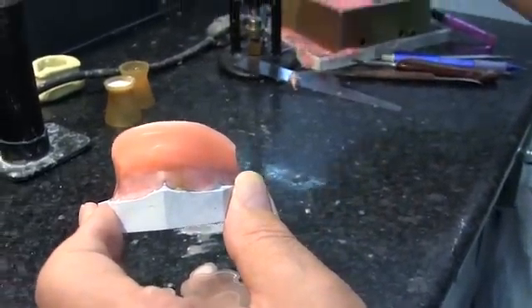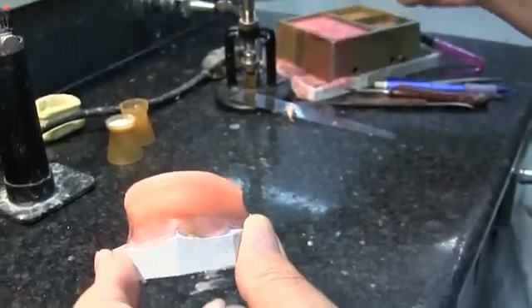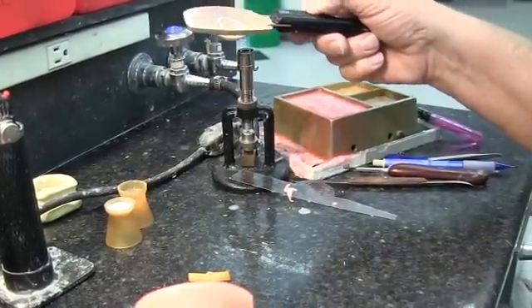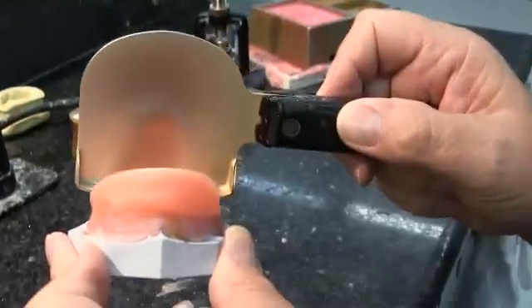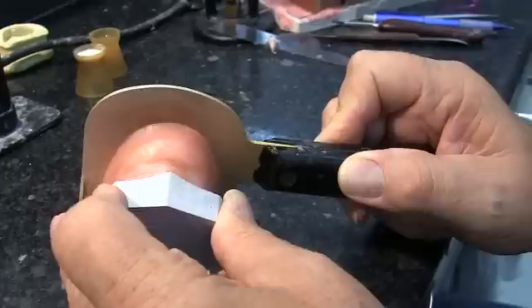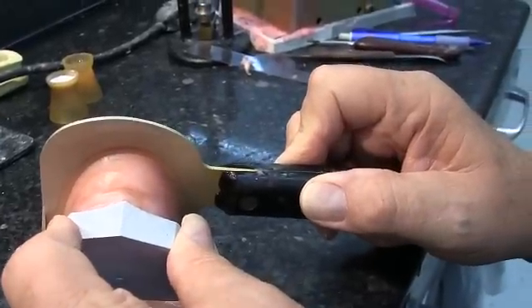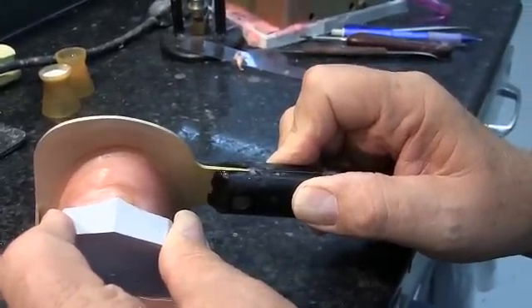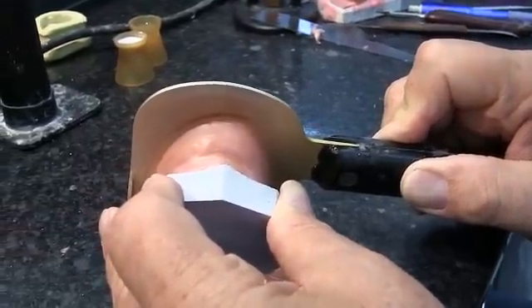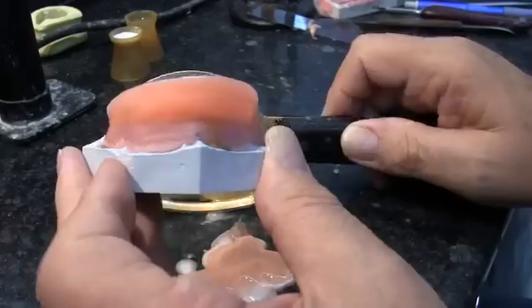We're still a little short, so we're going to heat our rim former up some more and bring it back over. We place that ledge back on the Hamular notch and pull the rim former down until we reach the 22 millimeter mark made on the baseplate. That will give us the correct height for our occlusion rim.